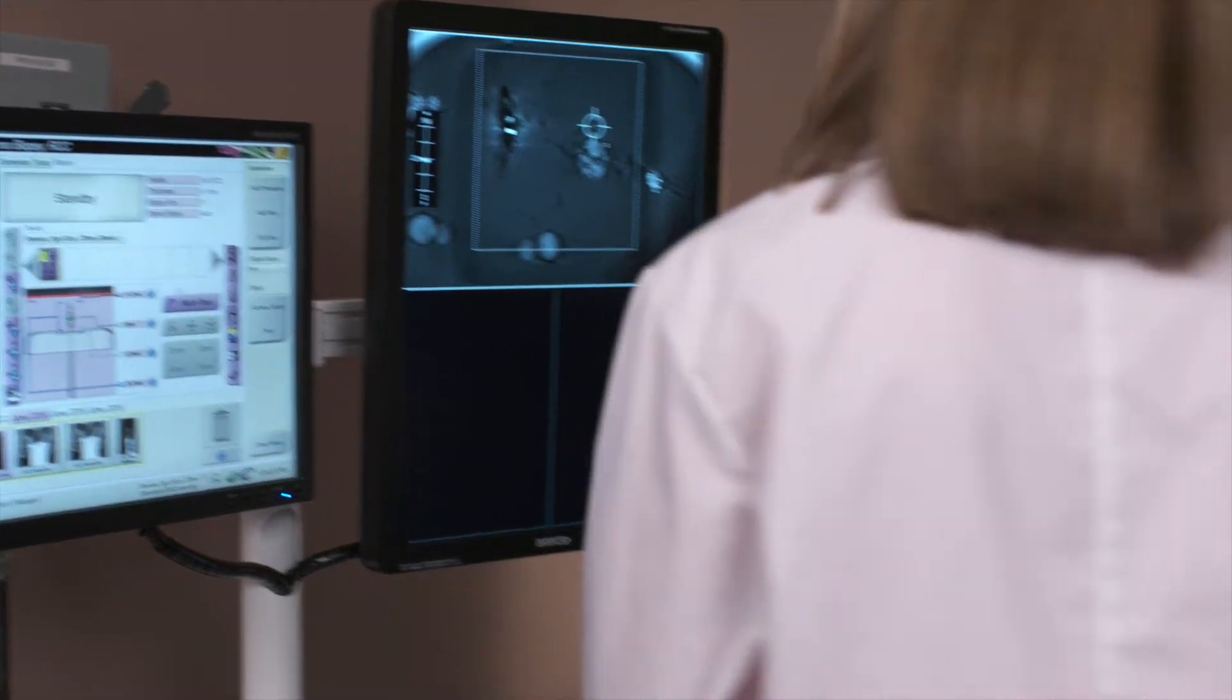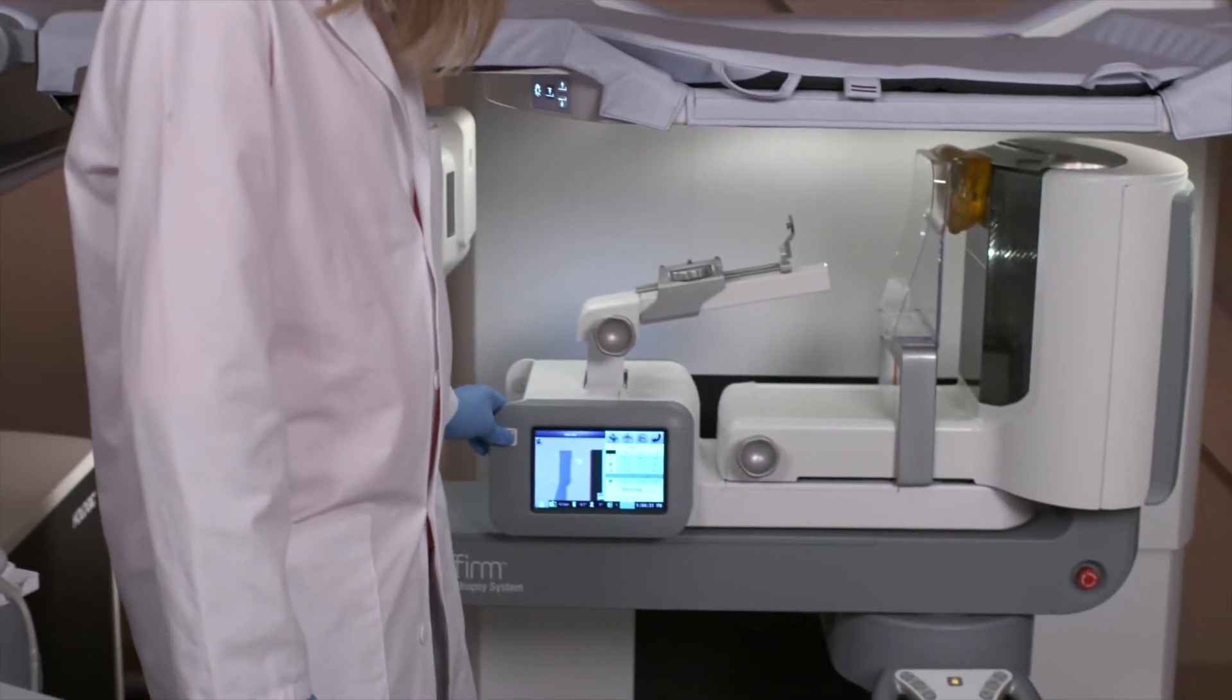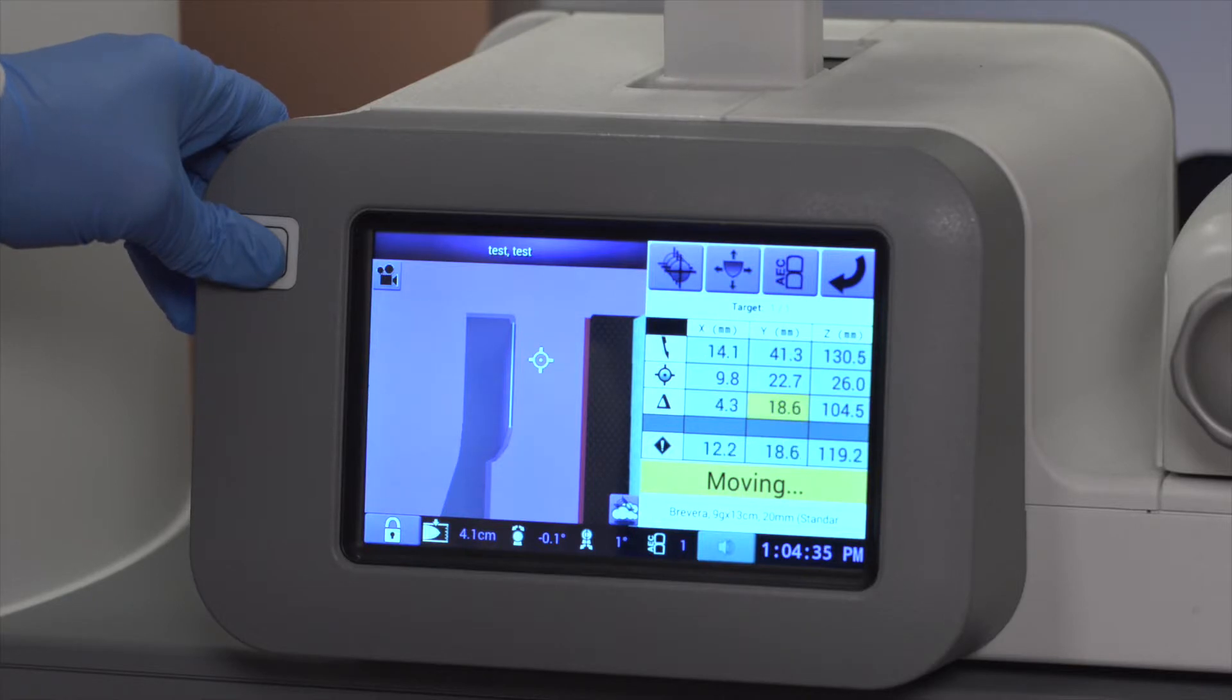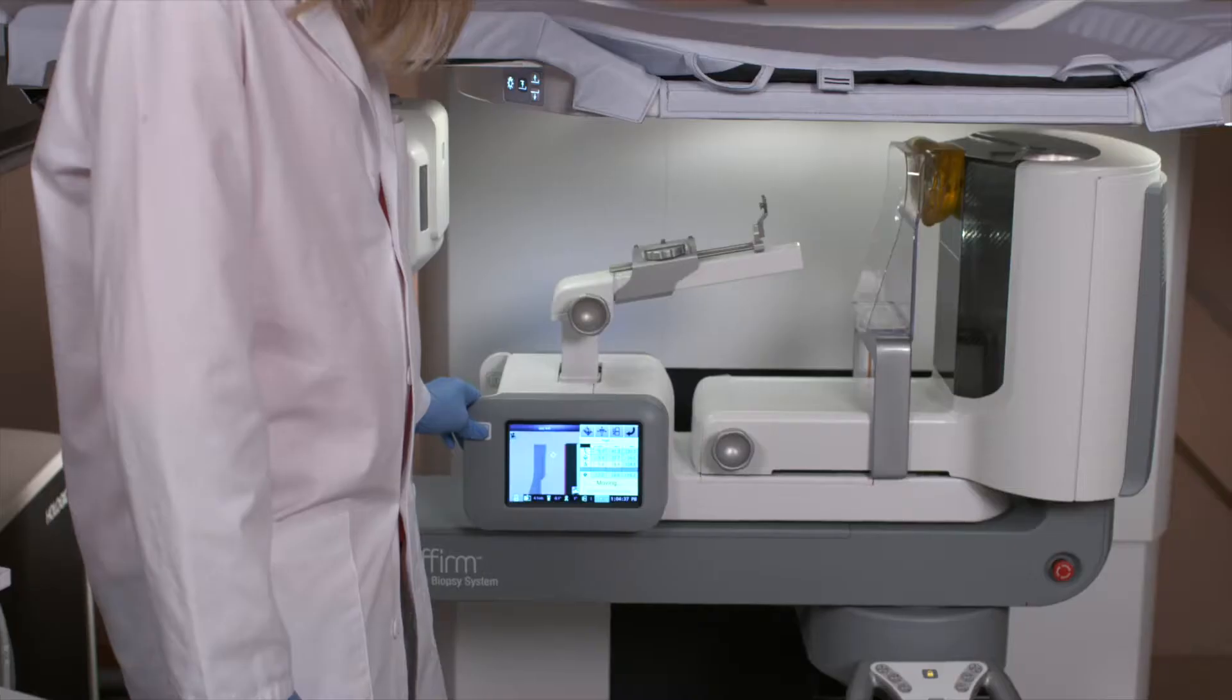The technologist will then motor enable the stage to the targeted position. The technologist will position the biopsy device mount by pinching two buttons on the biopsy control module at the same time to activate the motors.